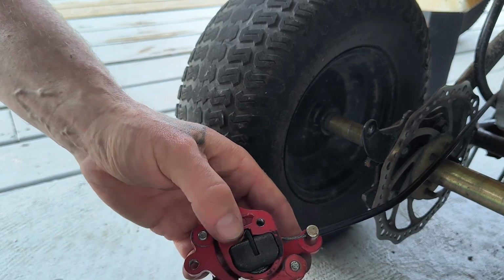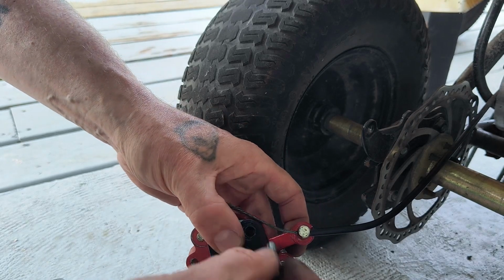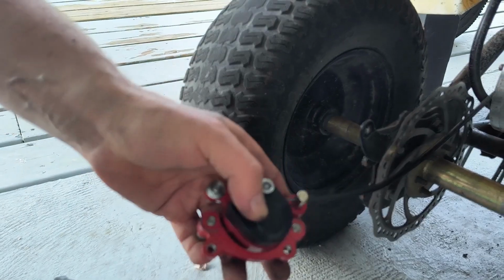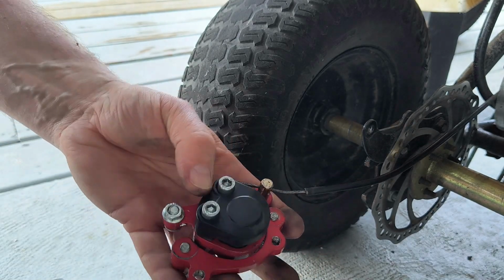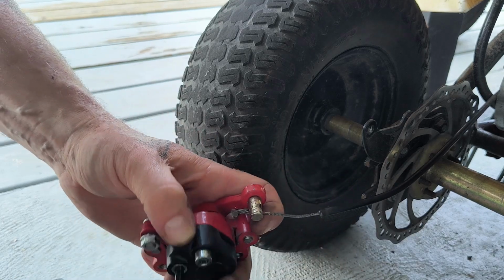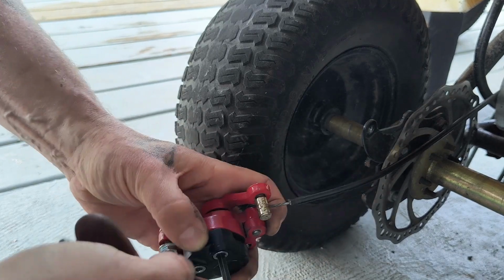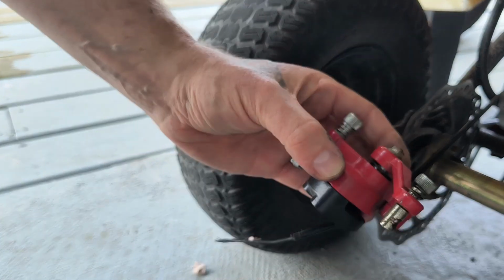Come on. See, you can't get this to work. There we go. That one in, got that one in. Tighten those down. I don't know about your opinion, but I think that looks pretty good.